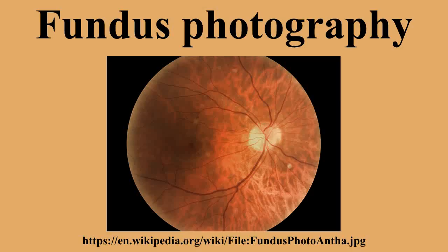Since then, the features of fundus cameras have improved drastically to include non-mydriatic imaging, electronic illumination control, automated eye alignment, and high-resolution digital image capture. These improvements have helped make modern fundus photography a standard ophthalmic practice for documenting retinal disease. Following the development of fundus photography, David Alves and Harold Novotny performed the first fluorescein angiography in 1959, using the Zeiss fundus camera with electronic flash. This development was a huge feat in the world of ophthalmology.